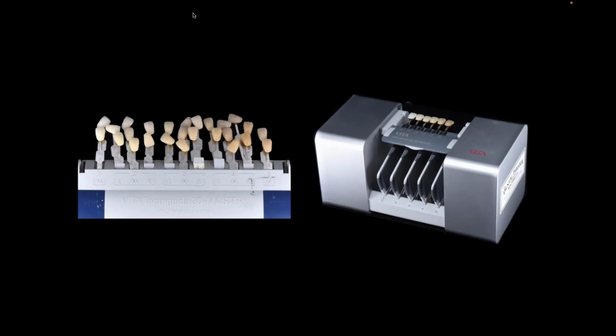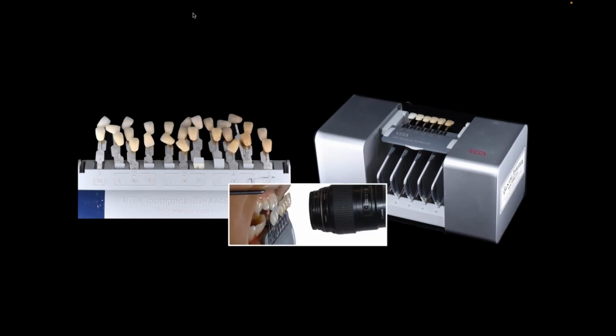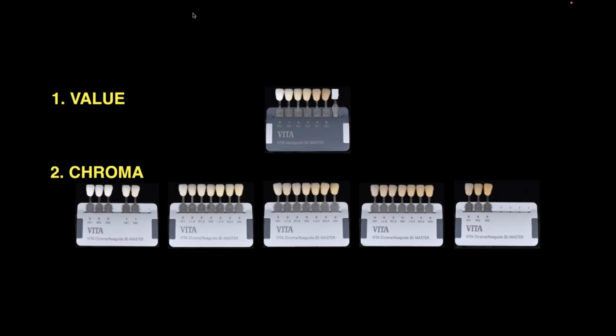I'm a fan of the linear system more than this 3D master system. And really, the only reason for that is, even though the system is very similar, the one on your left is just kind of messy to me, right? There's a lot of shades and they're kind of sticking out all over the place, and it kind of doesn't give you the formula for how to work through the process. So in the linear system, the formula is a little bit better. And what I mean by that is the first guide that I'm taking is really my value guide.